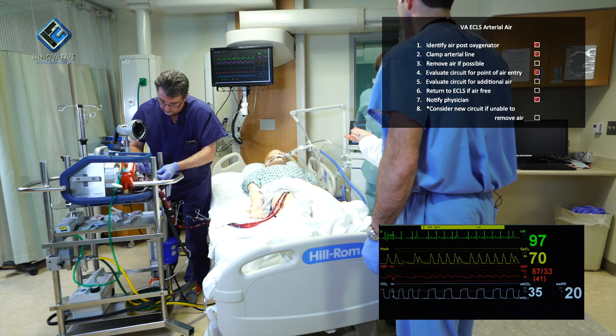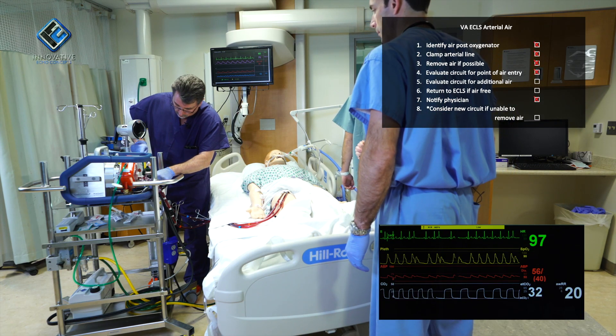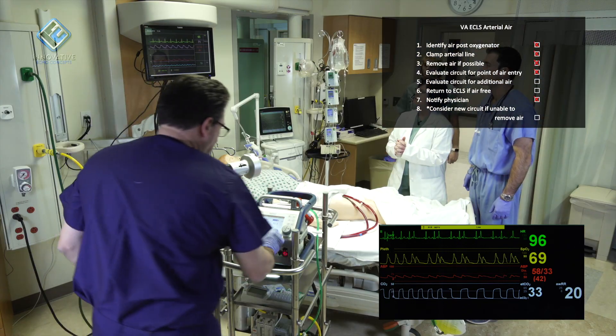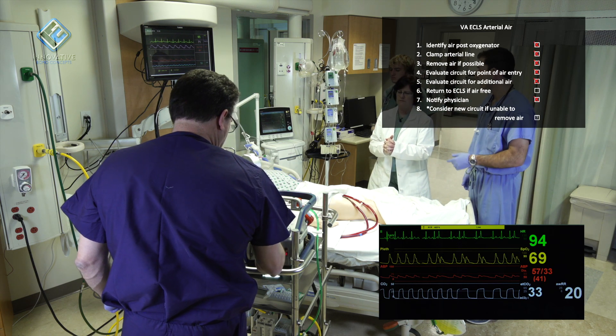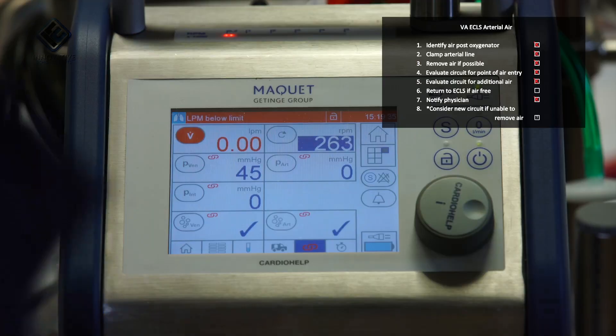The patient is hypotensive and desaturating. How much longer will the patient be off ECLS? Just a couple minutes. I aspirated the bubble and I'm going to reset the pump. Should I give a dose of epinephrine? No, I think at this moment we're okay — I just reset the pump.